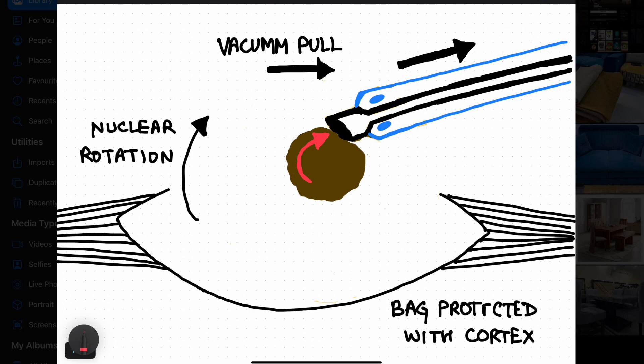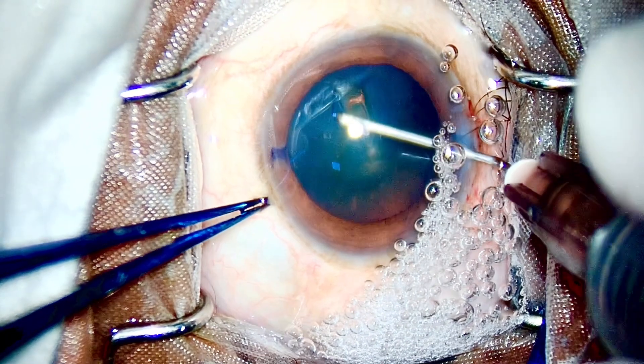After some seconds, only the endonucleus will remain. You don't have to stop — keep your pedal down in continuous mode. After a few more seconds, the rim of the endonucleus will be reduced and only the harder central part of the endonucleus will remain. Once this occurs, that small portion can be chopped off with a chopper if you are holding one in your left hand, or it can be taken straight away into the phaco tip. All this happens within a span of 10 to 15 seconds.